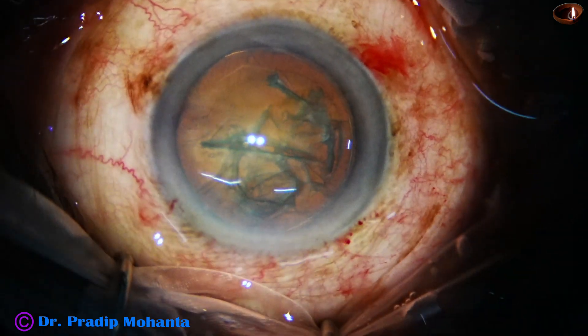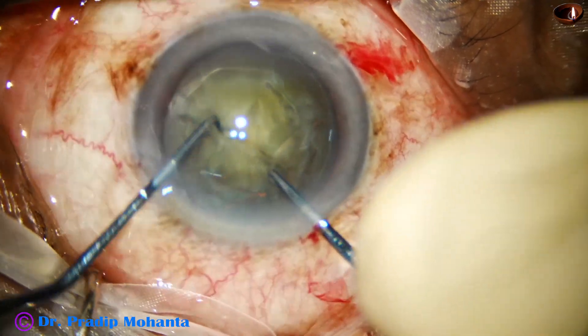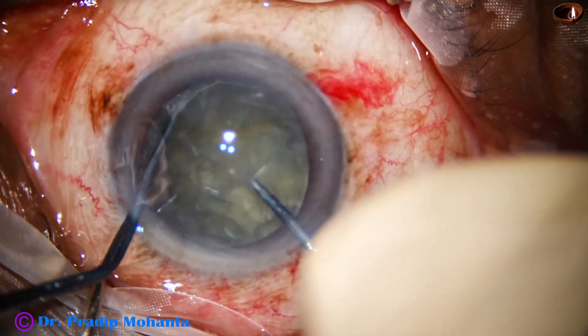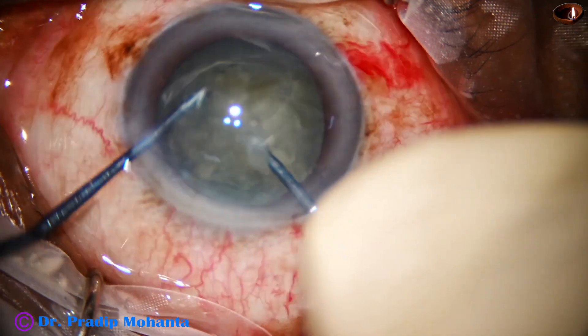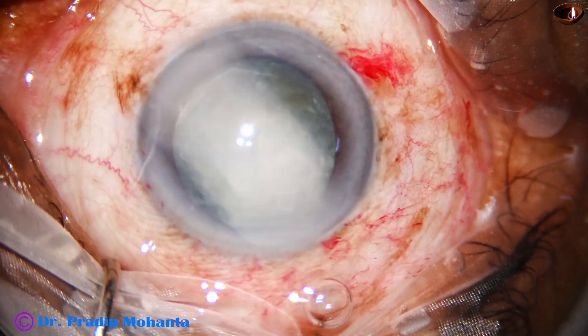Visco again. Now is the time to go into the anterior chamber with the pre-choppers — the pre-chopper and nucleus sustainer. The pre-chopper and nucleus sustainer divides the nucleus into two halves, then one half into two pieces, and then rotates and divides the other half into two pieces. So we have got four pieces in less than a minute.